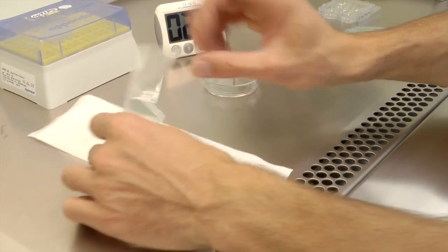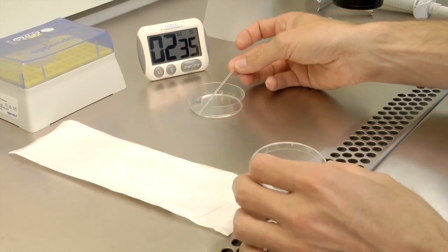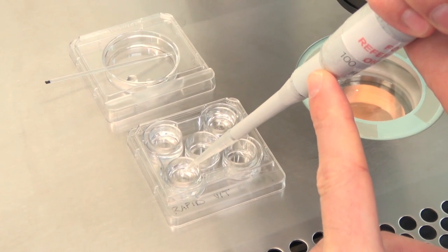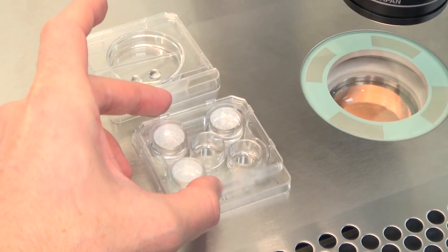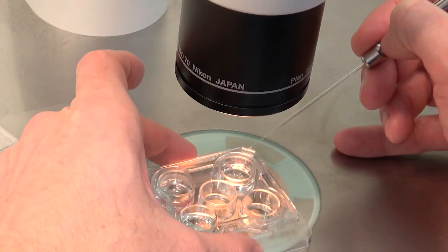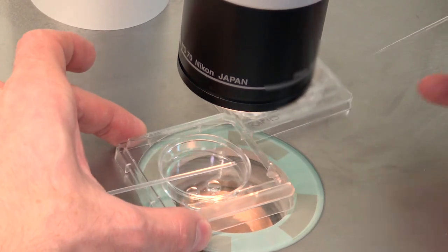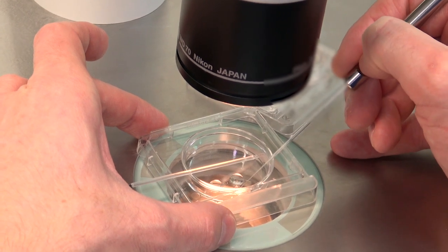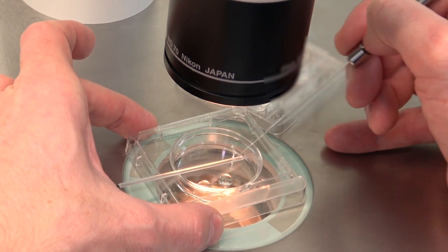Take the RapidEye and place it inside a non-toxic surface, for instance a culture dish, ready for use. When the oocytes have re-expanded or when less than 30 seconds in the second solution remain, make two 50 microlitre droplets of the third solution on a sterile, non-toxic surface, preferably a culture dish. Prime the pipette with the third solution and move your oocytes into the first droplet. Expel the remaining media outside the droplet and prime your pipette again from the second droplet. Immediately transfer the oocytes into the second droplet.